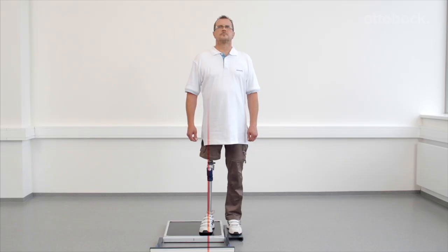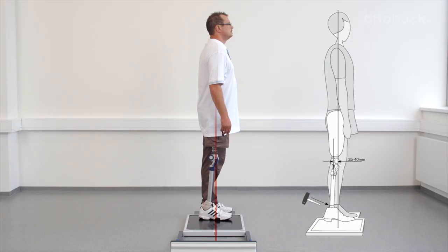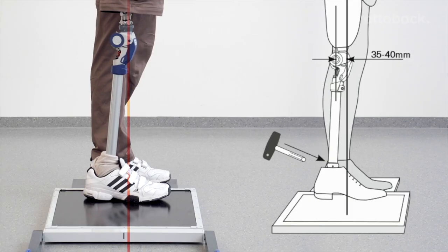Looking at the frontal view of the knee, the alignment reference line runs through the middle of the prosthetic foot, the middle to outer edge of the knee, and the middle of the socket. The alignment should now be adjusted solely by changes to plantar flexion, so that the alignment reference line runs about 35 millimeters anterior to the knee axis.